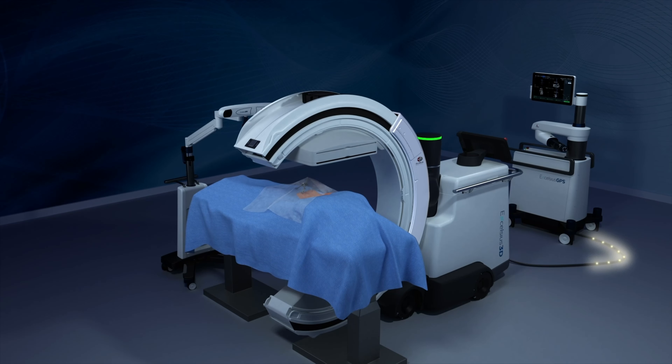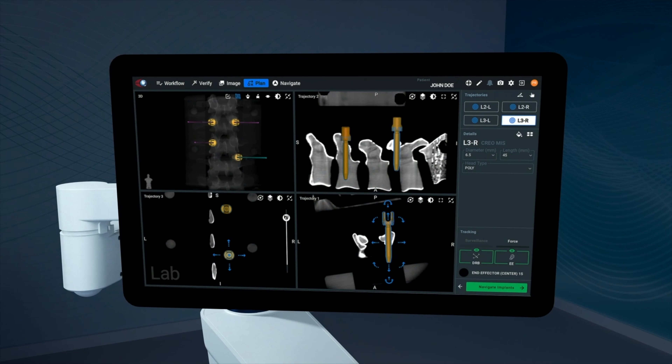The area is draped for sterility before bringing in an intraoperative imaging system to perform a 3D scan. The images are then transferred to the robot. Next, the surgeon plans the implants on the patient's anatomy.